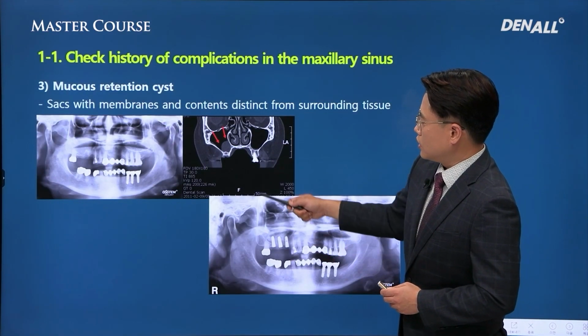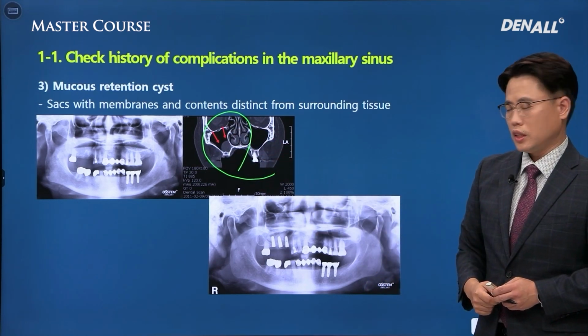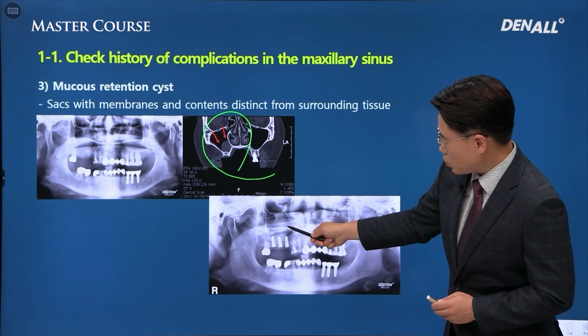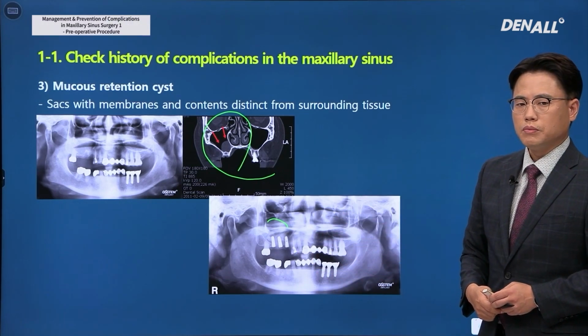It's the same with mucus retention cyst. On CT, you can make a diagnosis. Despite MRC, sinus lift was performed and good results were achieved.